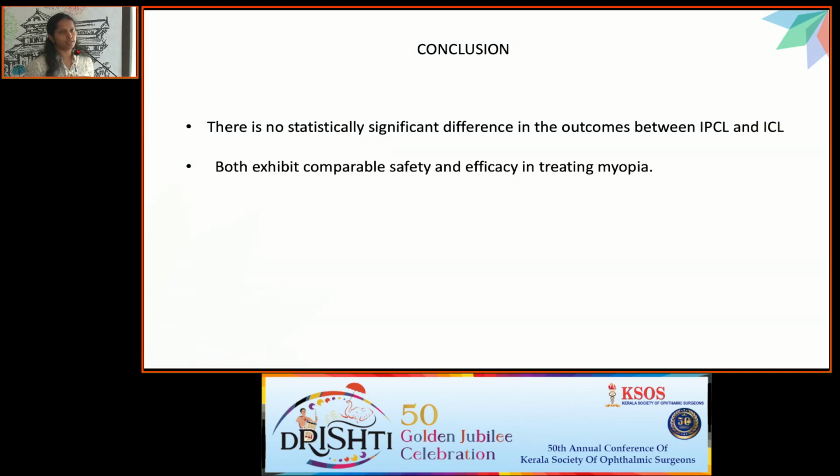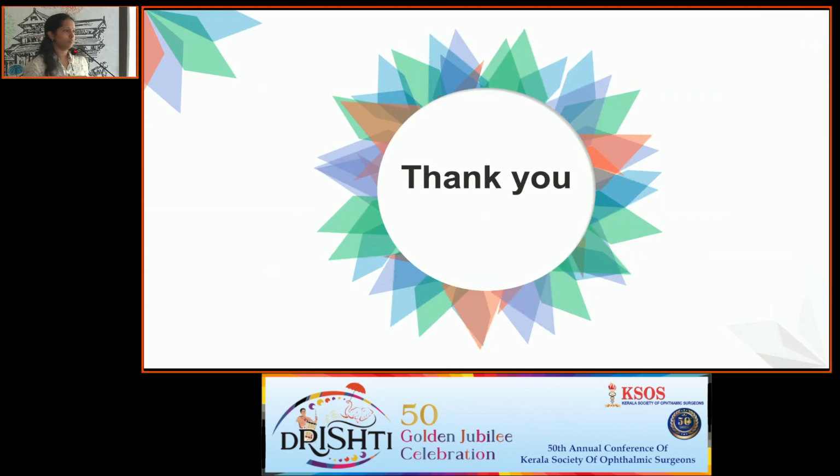And to conclude, there is no statistically significant difference in the outcomes between IPCL and ICL, and both exhibit comparable safety and efficacy in treating myopia. And having said that, IPCL may be a better option in patients who want a better refractive correction, and financial constraints may not affect them. Thank you. These are my references.